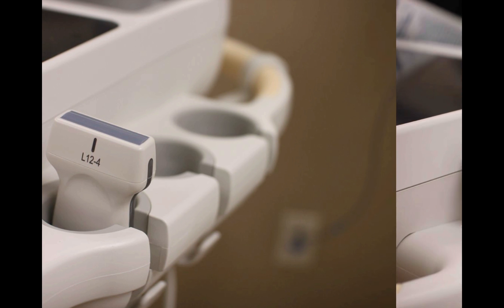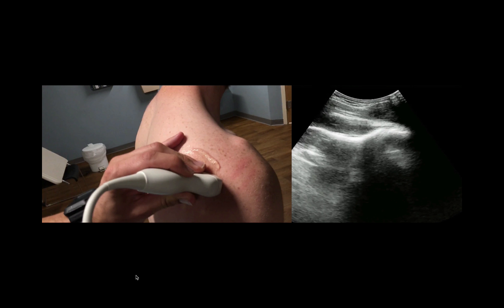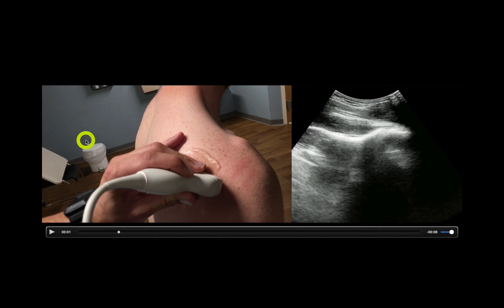Your probes of choice for this exam are going to be either the linear or the curvilinear transducer. Both can work. I tend to use a curvilinear a little bit more, but the linear works just fine. As far as where to place the probe on the patient, you want to place it in the posterior aspect in a transverse orientation. Generally, I have the probe marker towards the patient's left because I have the machine in front of the patient with the screen facing towards me, and I like left being left on the screen.